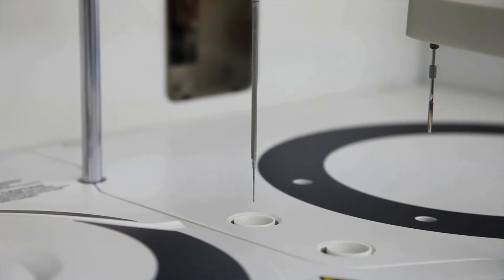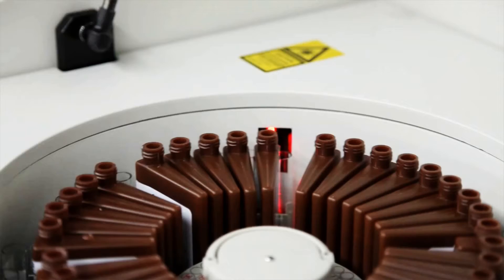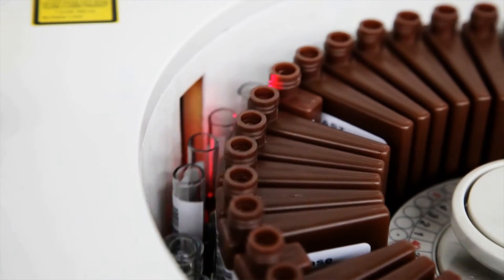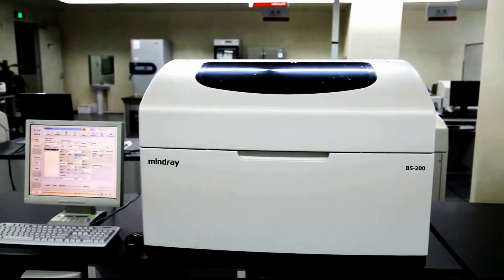The combined reagent sample probe not only performs liquid level detection, it also offers vertical and horizontal probe collision protection. An internal reagent and barcode reader enhances sample and reagent management. The BS200 analyzer is highly compatible with most LIS interface systems.